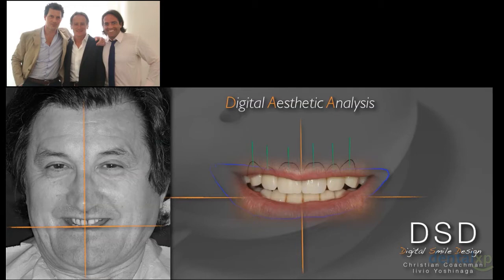And in this case, when patients see themselves on the screen, and see, especially in the picture on the left side, what we can potentially do for them, they are also more into the treatment plan. They are more compliant with us, and they are more positive.